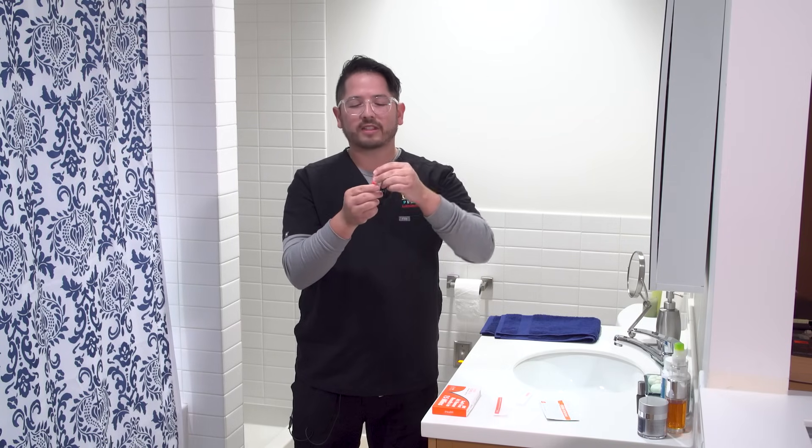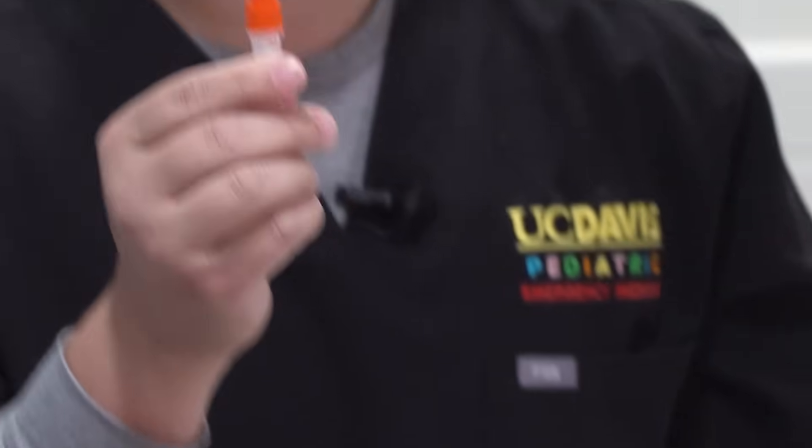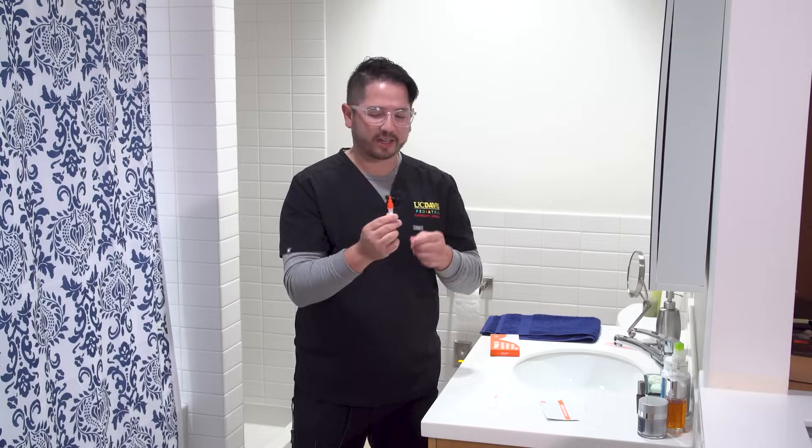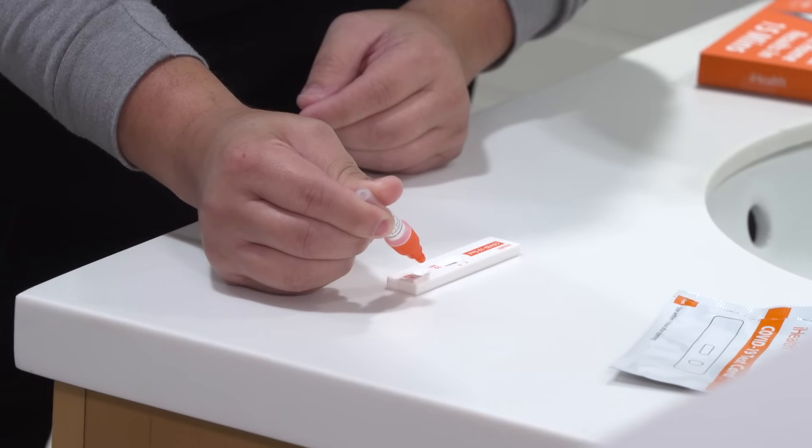Grab your dropper and this time you're going to take off the top cap. You can instill three drops into the collection chamber of your kit. One, two, three.